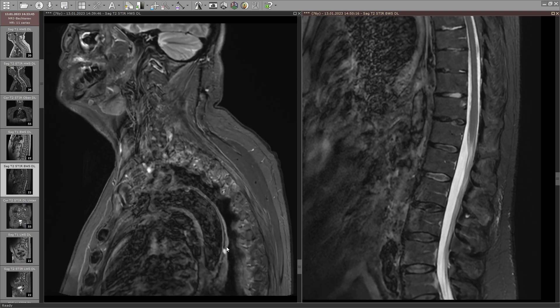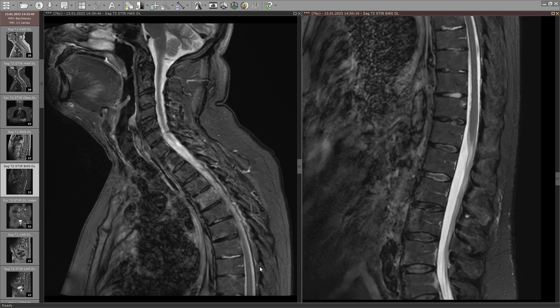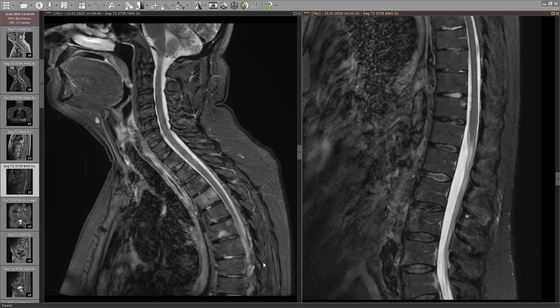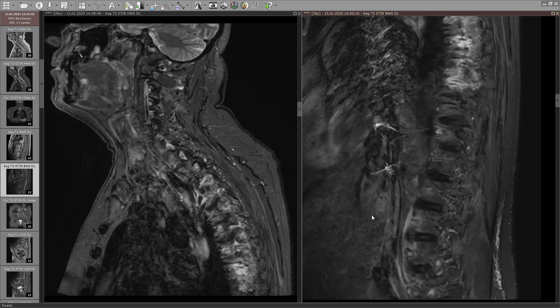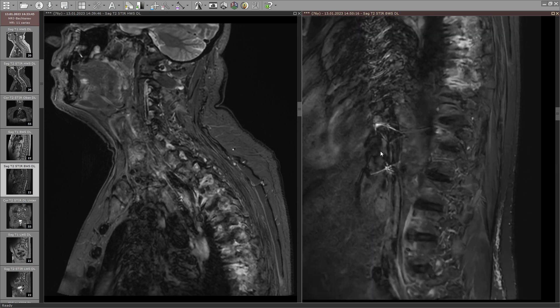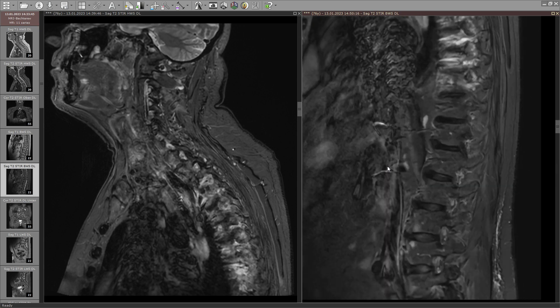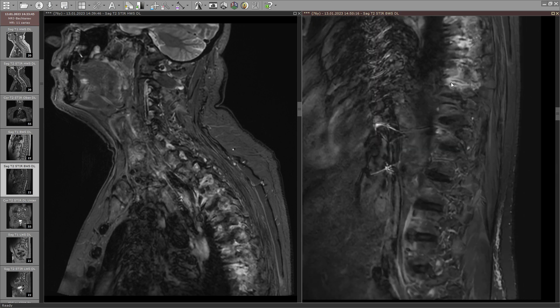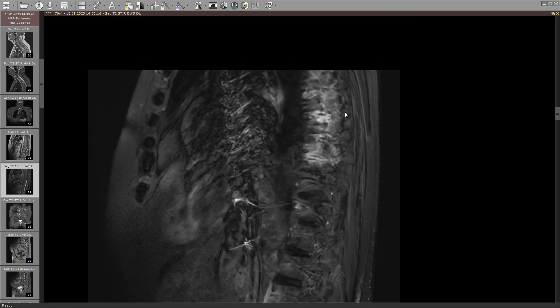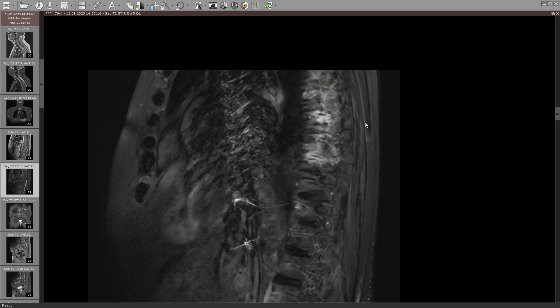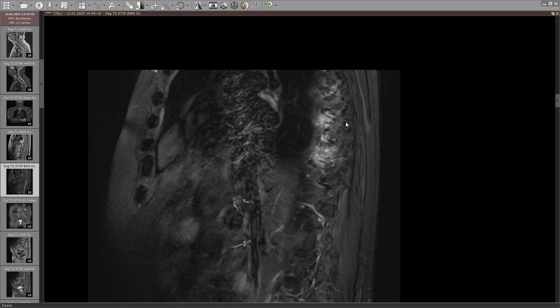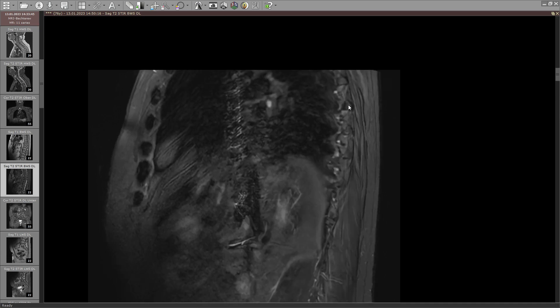Even if you scroll through like this, you might easily look over the actual finding here. Scrolling down it's probably easier to see. If you look up here you can see there is a lot of edema happening in that region — this is not normal. Normally we don't have edema on the lateral aspects of the spine.